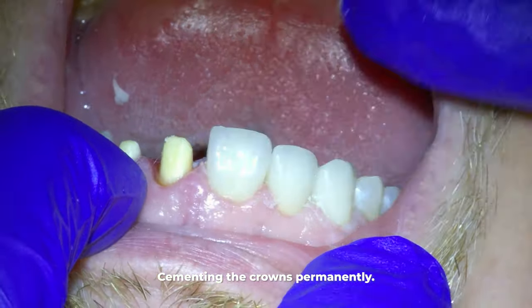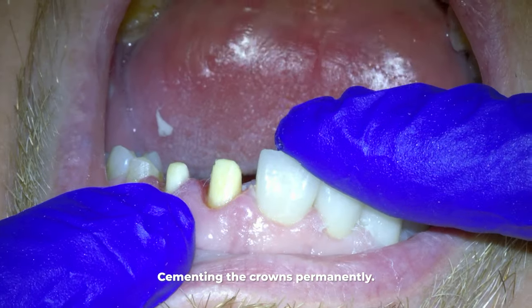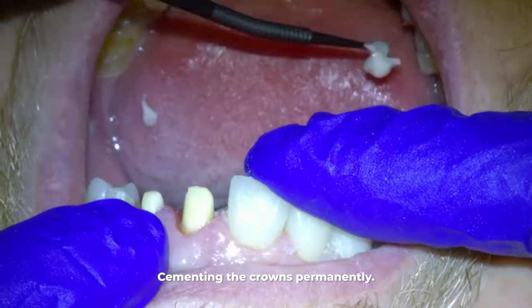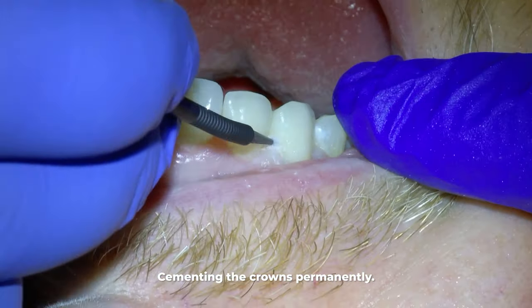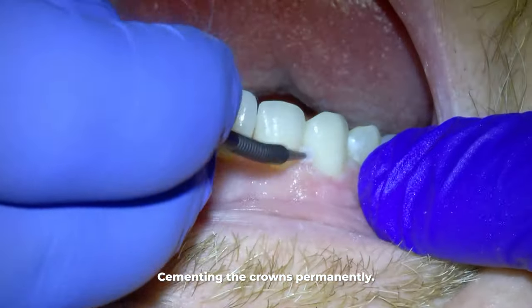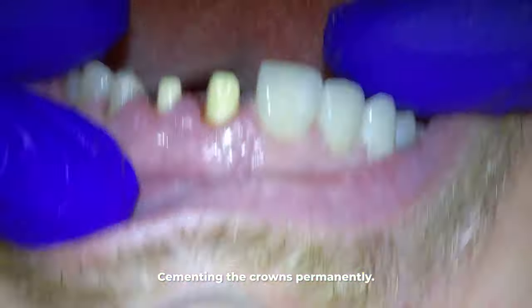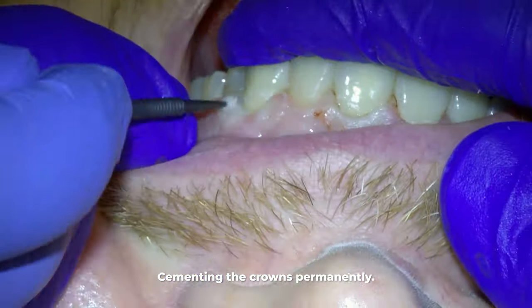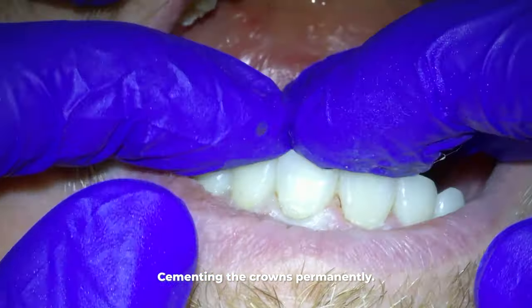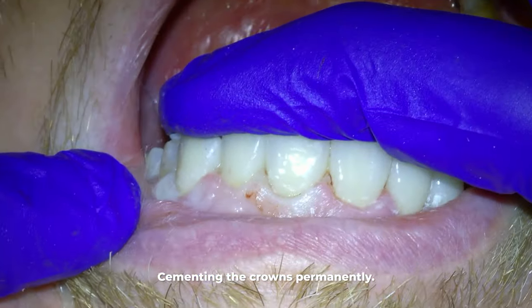Sometimes the patient isn't sure if they're happy about the crowns. In that case, instead of cementing them with permanent cement, we can take them for a test drive and use temporary cement. Then when the patient comes back, if he likes them, we take out the temporary cement and cement them with permanent cement. But the gist is your patient will get them to be what they want them to be.